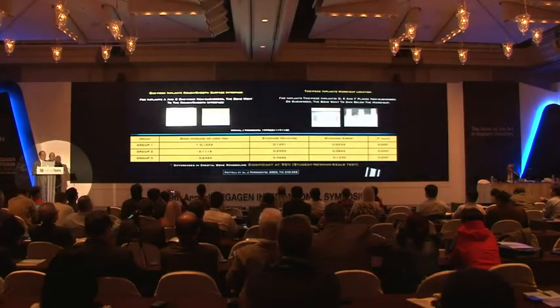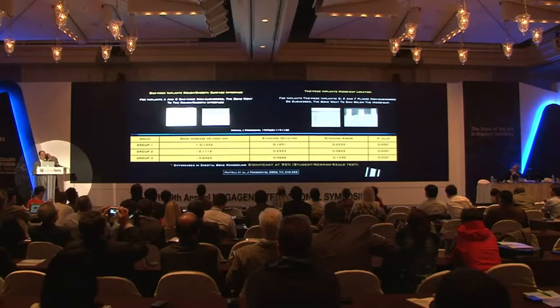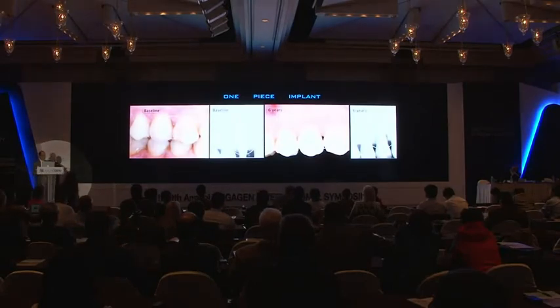In literature, Hermann's article distinguished the reabsorption of the crestal bone between the 1-piece implants and the 2-piece implants. In the 1-piece implants, the bone went to the rough-smooth interface. For this reason, it makes no sense to insert the smooth part of the implant under the bone. In fact, in this case, we submerged the implant, hoping to hide the smooth titanium, but, as we can see in the X-rays, it made no sense, because the bone went to the rough-smooth interface. The soft tissue followed the bone absorption, and this, in an aesthetic zone, is very dangerous.